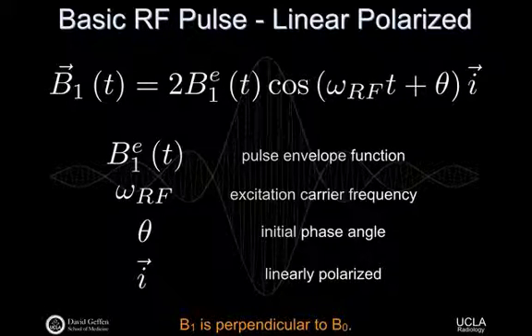That carrier frequency is going to be very different at 1.5T or 3T, right? So an RF pulse you've designed for 1.5T doesn't exactly work at 3T, something to keep in mind. I'll explain a lot more about the initial phase angle. This particular pulse here, we talked about being circularly polarized, right? I talked about lighting up those rungs in sequential order such that the B field is sort of circling around. You don't have to do that.